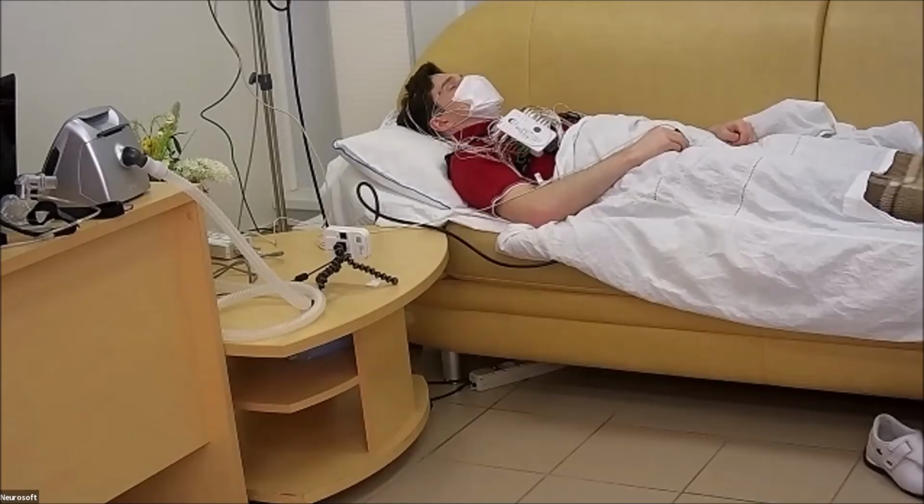They are able to take the device to the patient's home, take a laptop and a small video camera, like, let me show you, like this one right on the table. It is a small portable night vision camera.